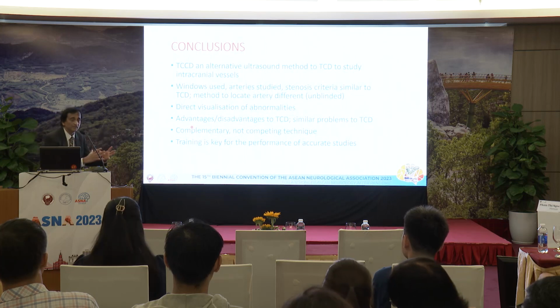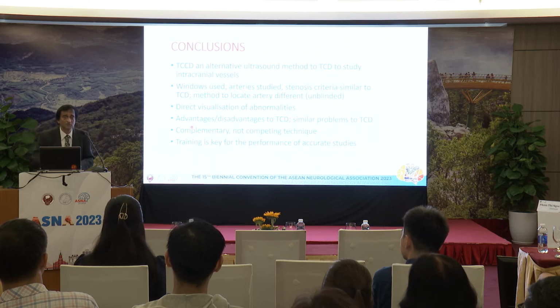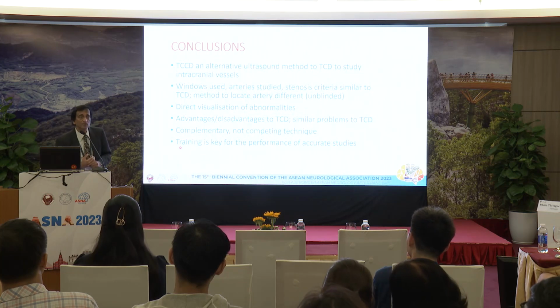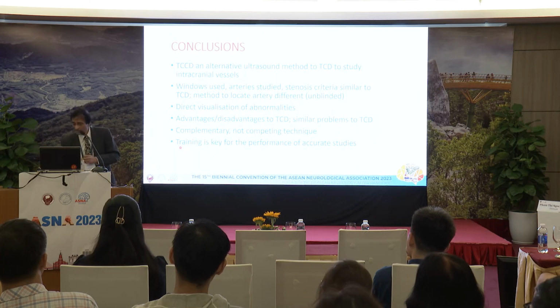It's very portable, the TCD machine. Go to ICU. This machine is not so easy to move. It certainly can be done. You can put a TCD machine in your backpack and rush to the emergency room. You probably can't put this into your backpack, unless a very big backpack. But whatever it is, training is key. Come for courses, go for exams, be certified, and I'm sure you'll help your patients very, very much.